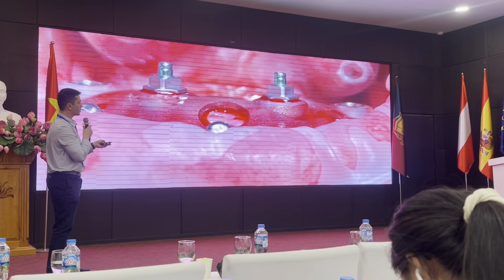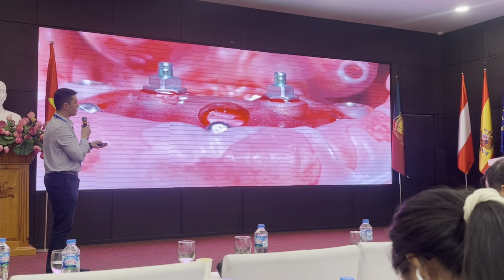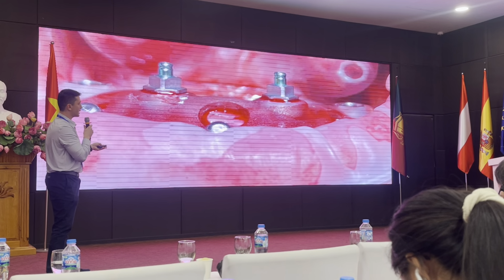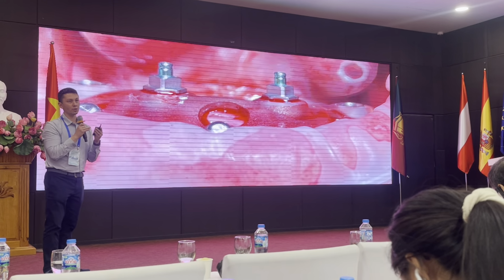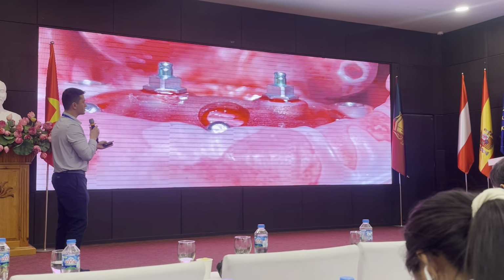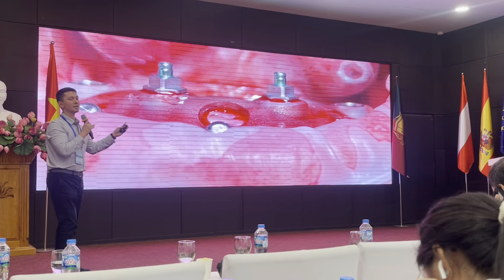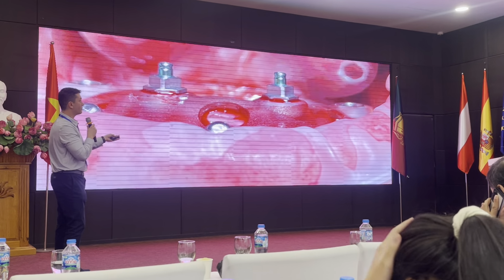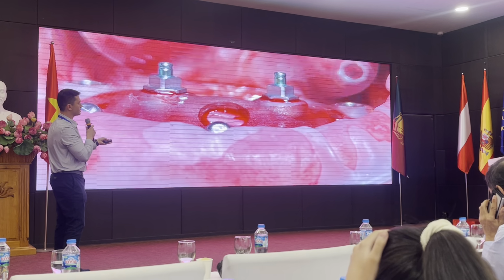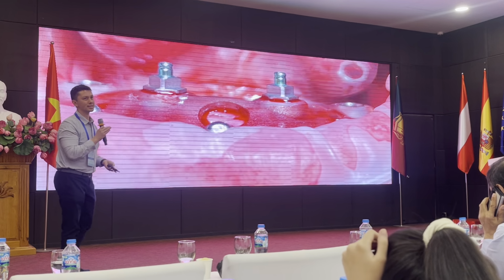When a surgical guide has metal sleeves, they're designed to have this hexagon in the angle and the orientation that you planned. This is really a finesse, more advanced, and we don't need it for this case, but I like everything to be nice and neat.